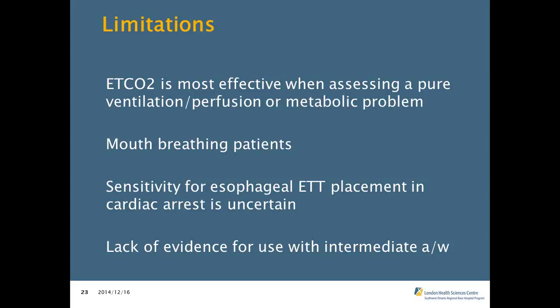Absolutely. So there you have both a pump problem, so an issue with perfusion, and also a ventilation problem because of pulmonary edema. So that's when it becomes very tricky to discern what's going on from your capnography alone. So in pure instances of one issue alone going on, it's much more helpful than those other mixed ventilation perfusion issues, such as in CHF with an MI.